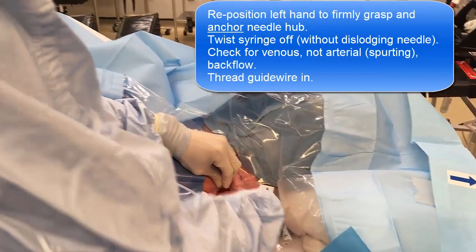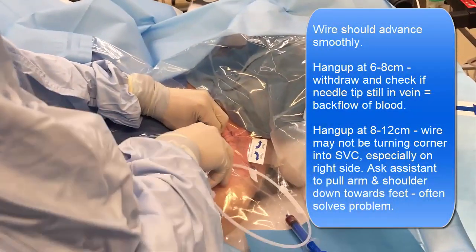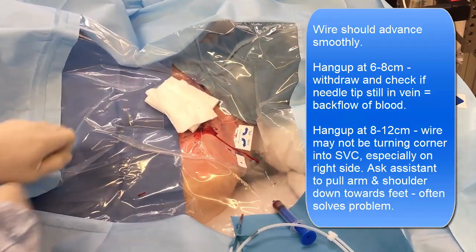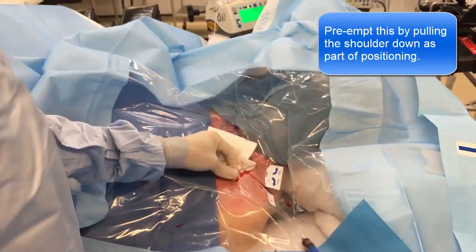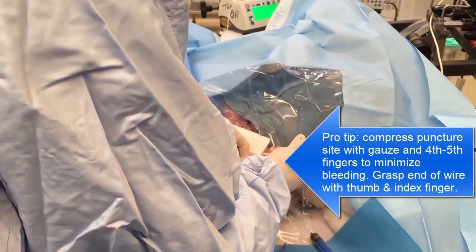It's not threading back. Now, one thing that sometimes happens — especially on the right side — is that the wire won't feed. In which case a good manoeuvre is to get an assistant to pull the shoulder down. I actually pull the shoulder down beforehand. The rest of it is just like any other central line.